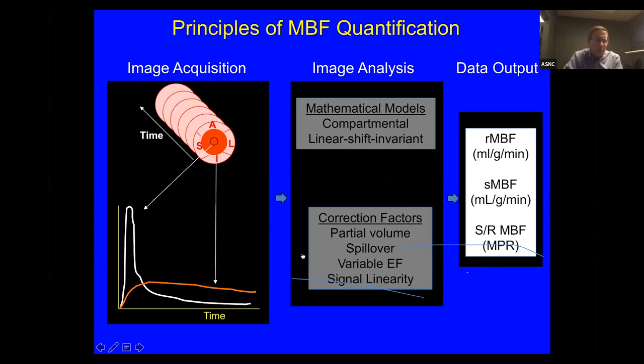We talk about flow, of course, our images or perfusion images. Well, it's static perfusion. And what we've done here is we've taken an input function. You've watched the isotope come through the myocardium and you add a time domain. And our output is nutrient myocardial blood flow per gram of myocardium per unit time. So that's the difference when we're talking about static perfusion versus the time domain of flow and flow reserve and flow quantitation.